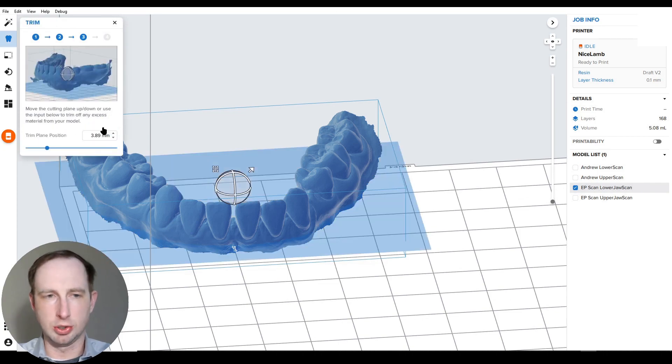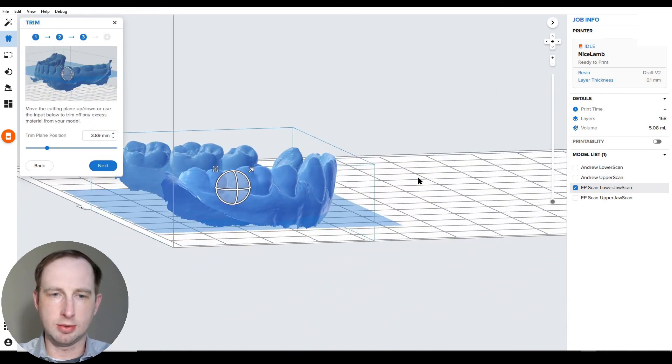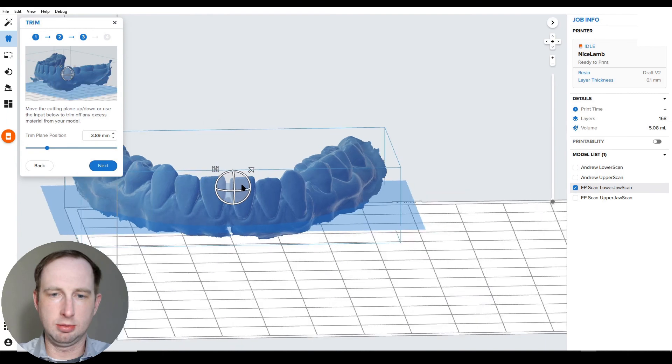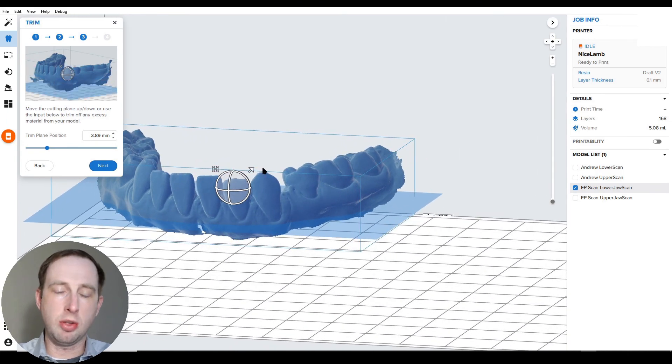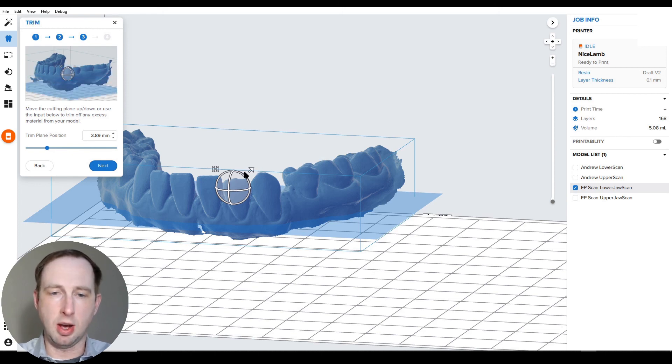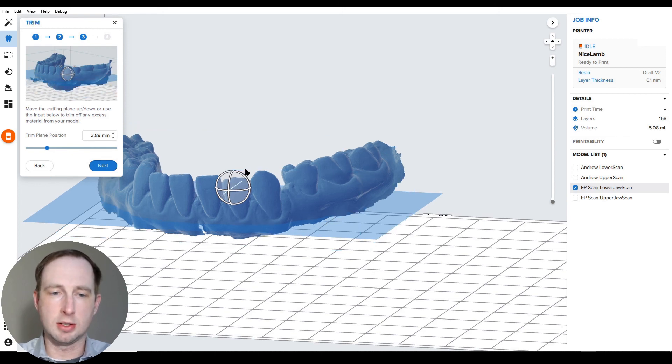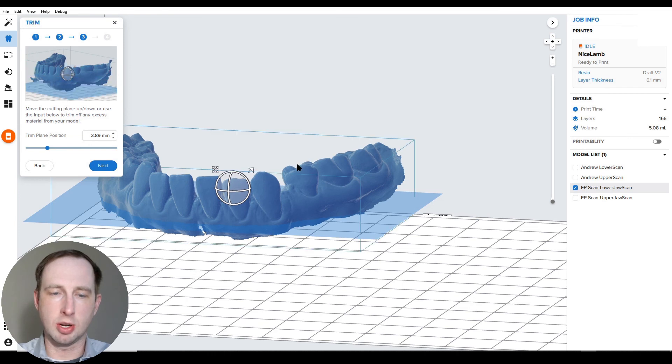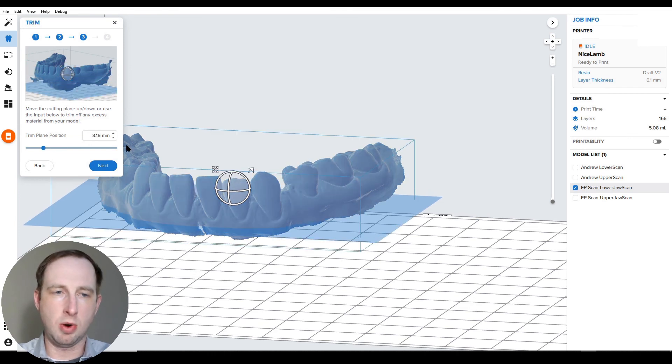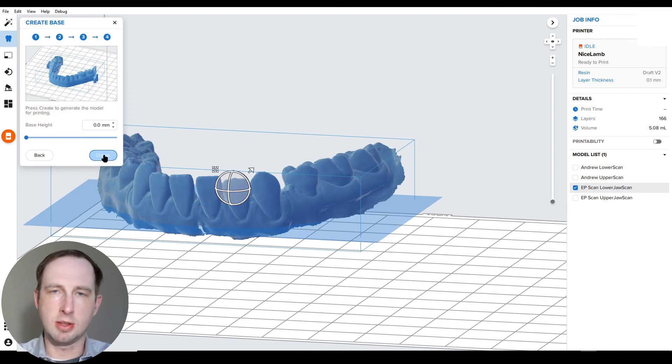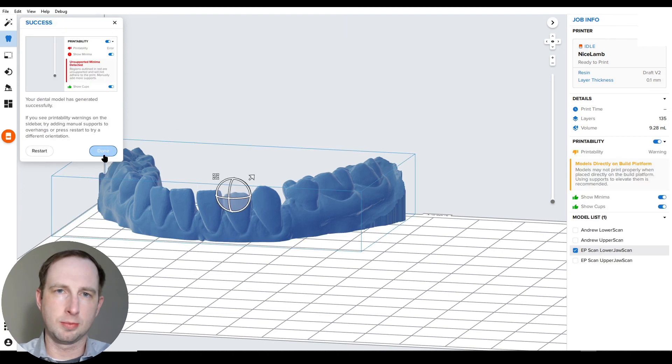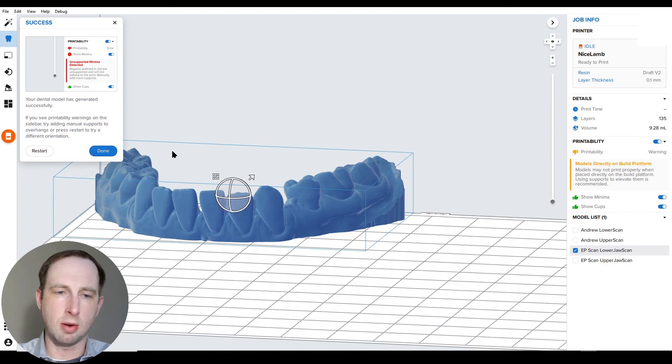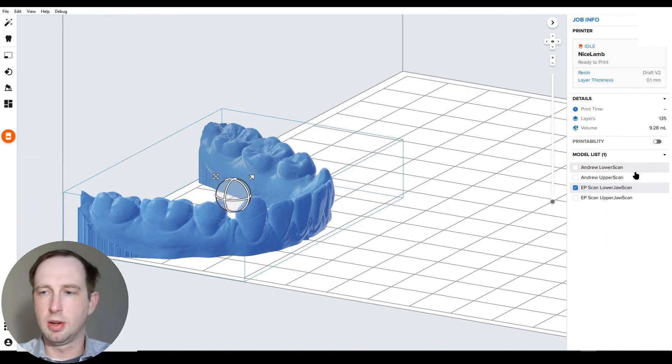Next, orientation's good. Trimming plane, this looks really close to where we'd want it to be. And the other really neat thing is you can make rotations to the model here in this step, even the next step. It doesn't finalize until the last step, so you can make a small tweak, just like what I'm doing here, and then notch it down a little bit if you want, and you're ready to go. So moving on, again, we'll do no base height, let's just make these zero again, like the other three before it. So let's calculate this. Okay, our model is now built, done.